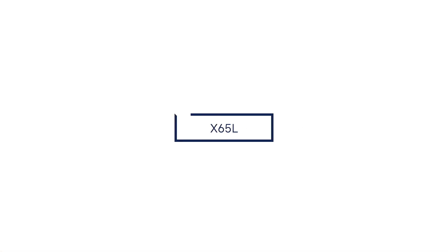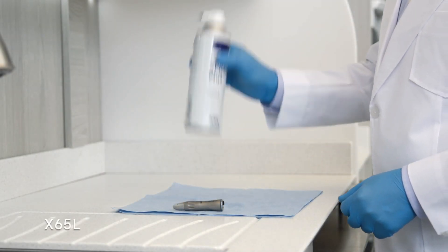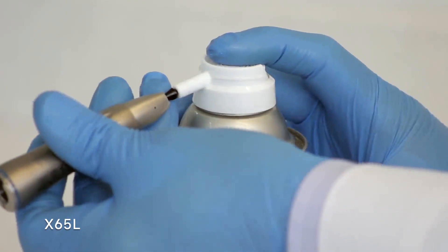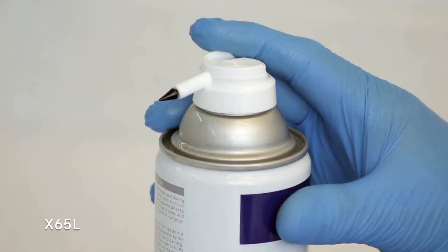Now here's the process for an X65L straight nose cone. Shake the can three to four times. Hold the can in an upright position. Insert the nozzle directly into the chuck and spray for two to three seconds.